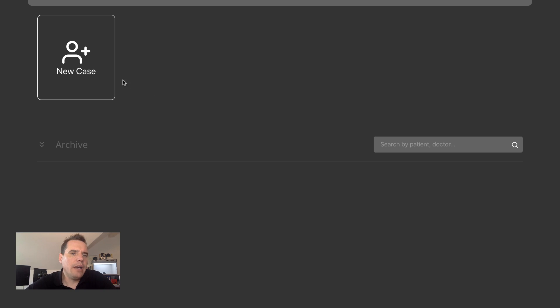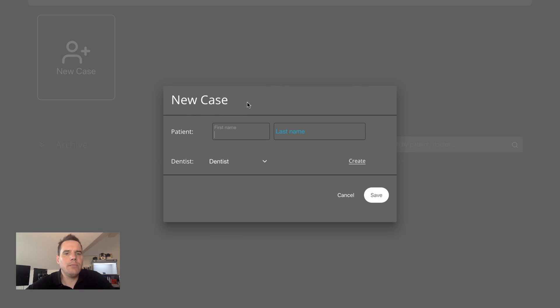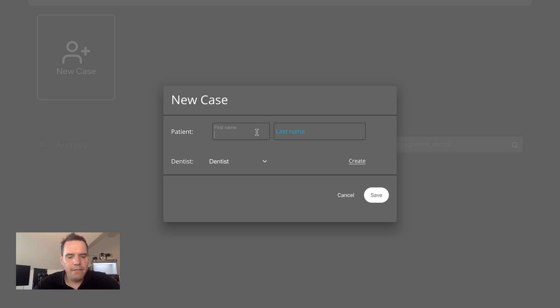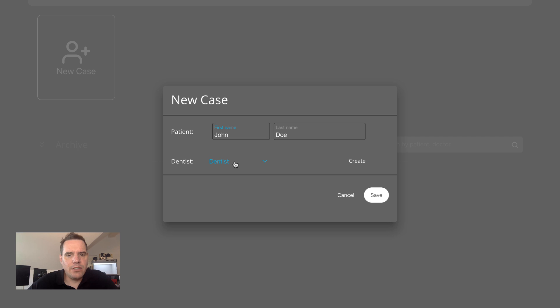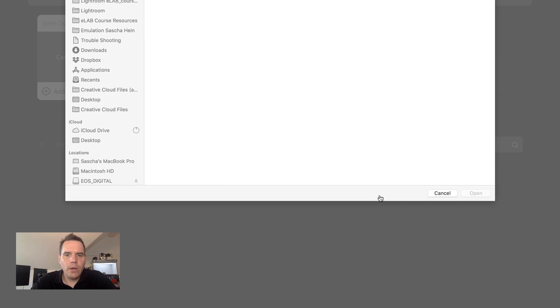So you begin by creating a new case. You simply click here and this window comes up, and elabprime wants you to enter a patient name. We're going to use a fictitious patient called John Doe for a fictitious dentist called Dr. Feelgood. Then you click on save, and this way all of your cases are neatly organized and easy to find later on as you're accumulating more and more cases.